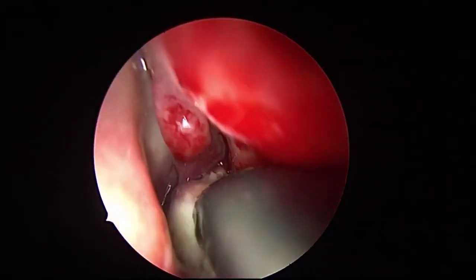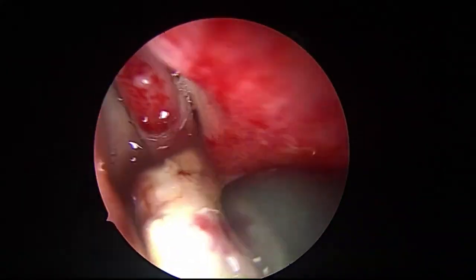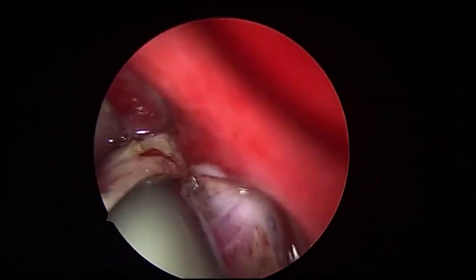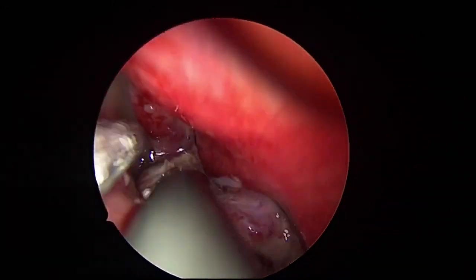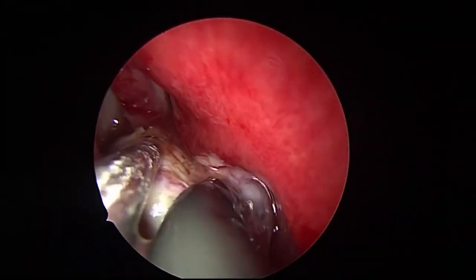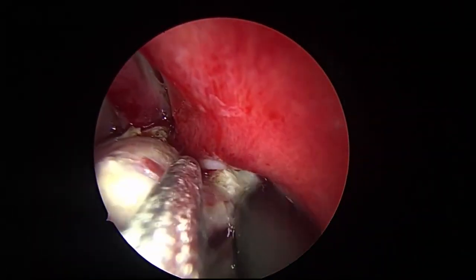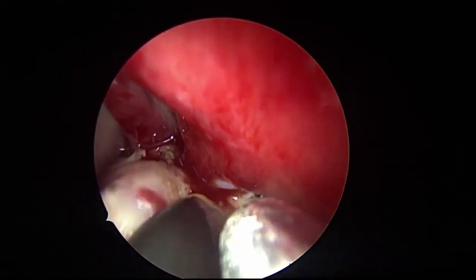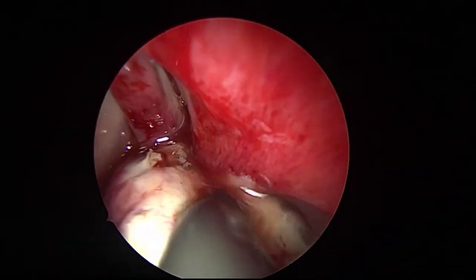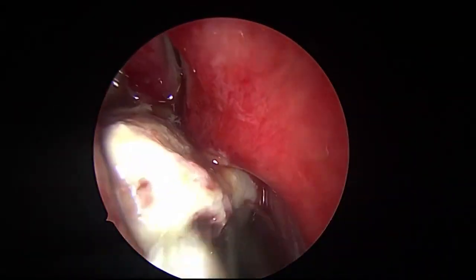See what I am doing? Since most of the vascularity is on the surface, do surface coagulation. This serves not only the purpose of reducing the vascularity on the surface, at the same time it shrinks the tumor as well to give you more and more space. The audience must see that he's just touching the coagulation, not actually pressing on it, just brushing the coagulation mode over the entire tumor.